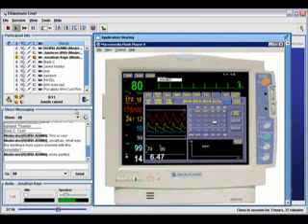So the critical aspect is knowing exactly what you want the person to be able to accomplish in the simulator, and then defining the amount of deviance or interactivity that you would allow them to deviate from the correct paths.